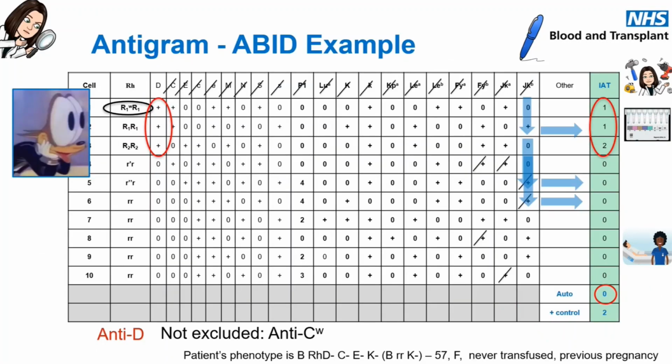Sorry, I should have said. I think it's one of these. I know what it means, so I've just automatically assumed everyone else would. So the positive control is just an incubation control. When we perform a manual antibody ID, we have to put an incubation control up.